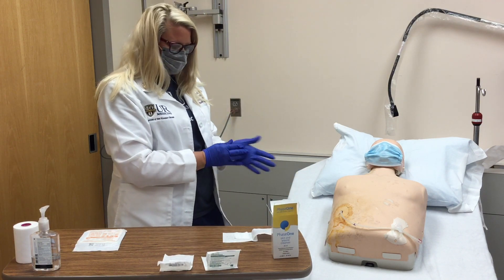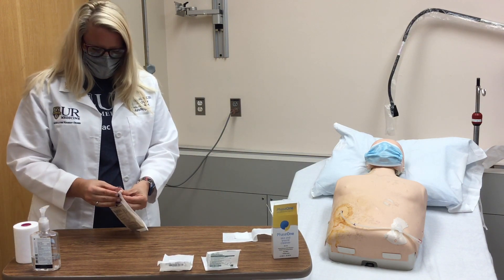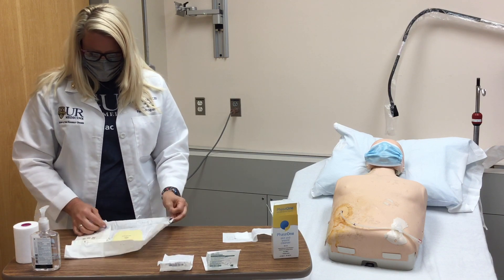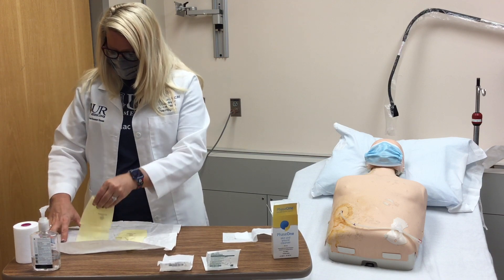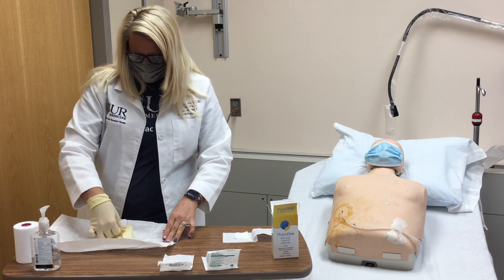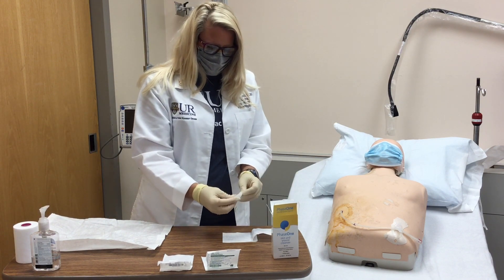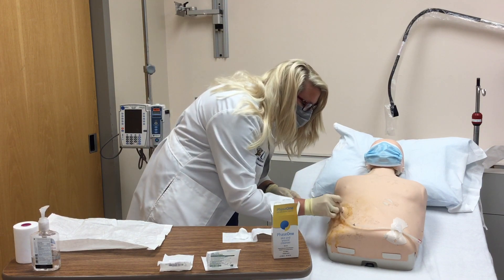We're going to remove our gloves and apply sterile gloves. Use the pre-moistened Phase One gauze to remove any buildup, working your way from the center outward, and allow to fully dry.